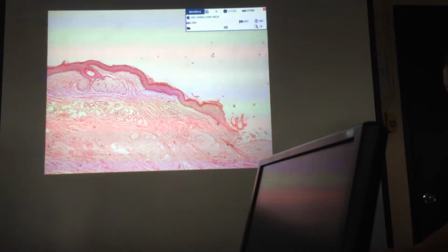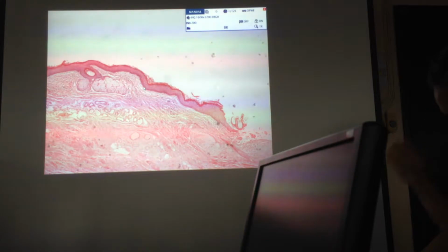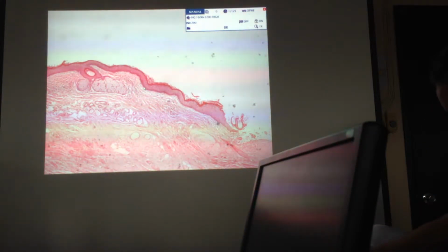Okay, so mature cystic teratoma. For mature teratomas, they can be solid or they can be cystic. Okay? Pag sinabi mong teratoma, it would mean that there's a mixture of the different germ cell layers, yung ectoderm, mesoderm, endoderm. Lahat sila rolled into one, nandun sa isang tumor na yon. Okay? And they're usually benign.